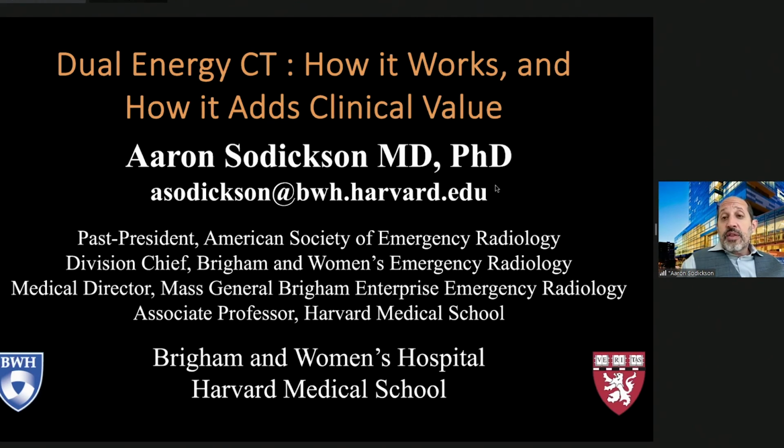That said, I think those projection-based metal artifact techniques like IMAR are far better than what you can get with dual energy. People have talked about using high keV virtual monochromatic images to reduce metal artifact, and it's highly variable how well that works depending on how much metal there is and what the configuration of the metal is. So my personal feeling is that I've found a lot more success with IMAR over high keV dual energy images.